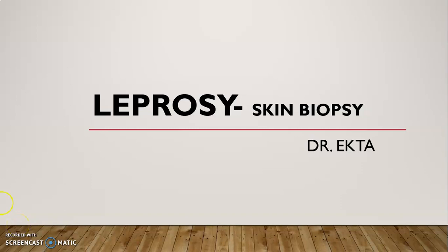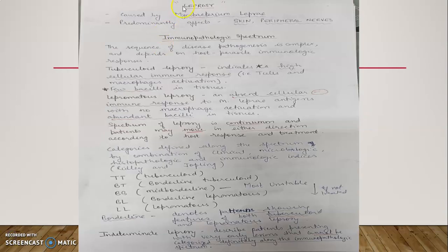Hello everyone. The topic for today's discussion is leprosy. We are going to cover skin biopsies in leprosy. As you all know, leprosy is caused by Mycobacterium leprae and it predominantly affects skin and peripheral nerves.